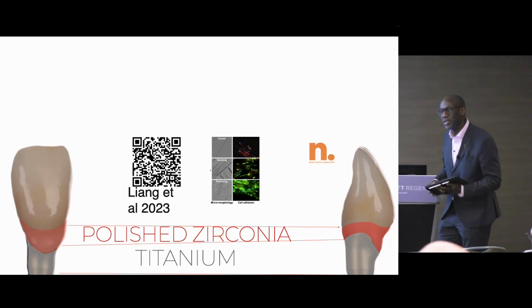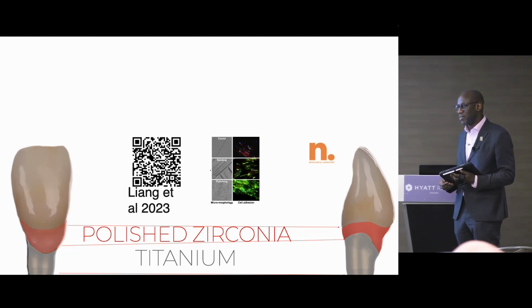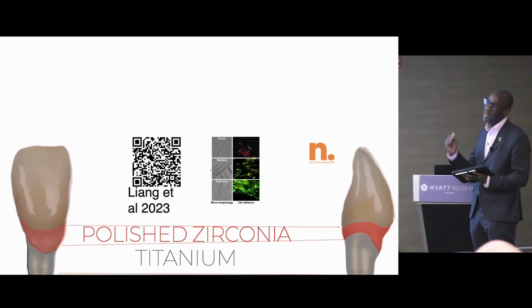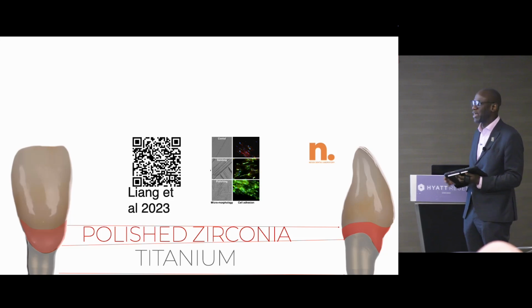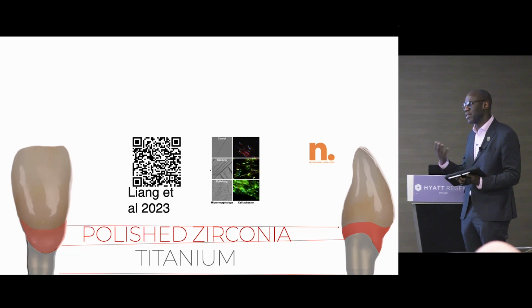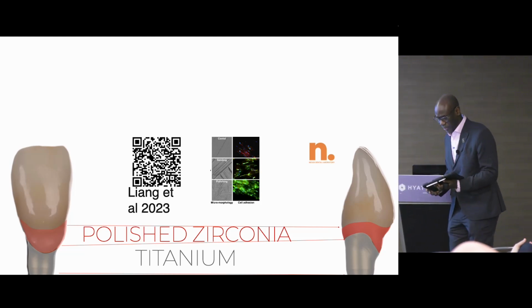Sorry, did you have a question? Sorry to interrupt you. Say polished zirconia versus glaze? Yes, glaze ruins it. It has to be super polished, and glaze should not be in any subgingival area at all. You won't get that attachment with the glaze in place. So you're back to what we used to have with metal ceramic. In some ways, you won't get the same attachment, and I think it's taking away a lot from the material and what you can do with it.